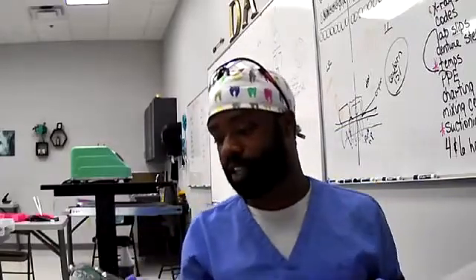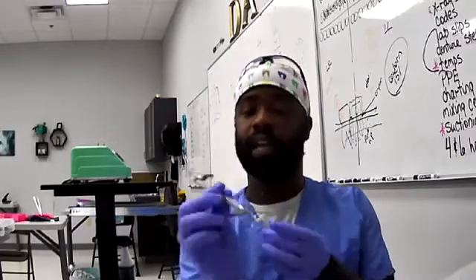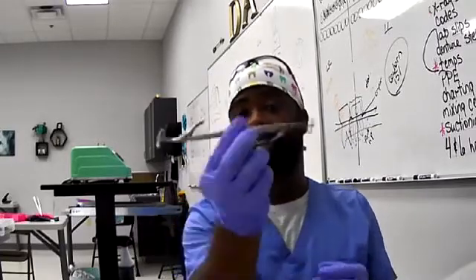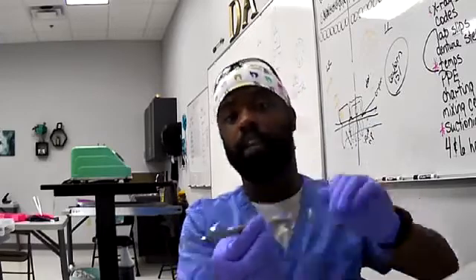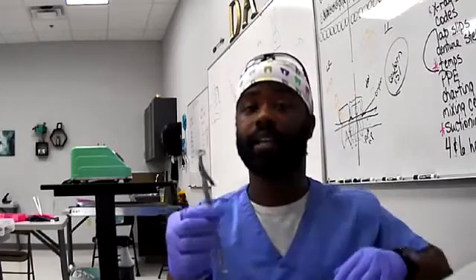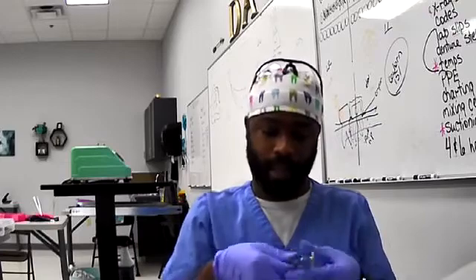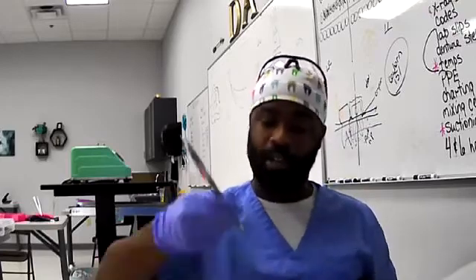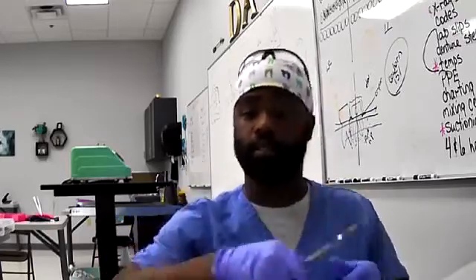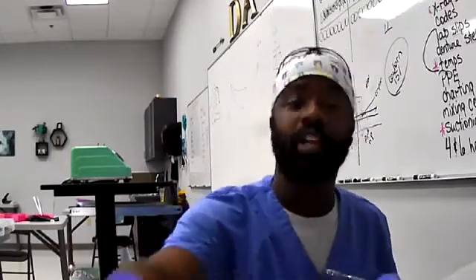If you're going to work with the big side first, then you want to hand the dentist that side down. Okay. So if I'm handing it to you, you're the dentist, and this is the big side, I would hand it to you like this. That way, if I'm the dentist, I grab it and put it right into the tooth, hand it to you, or swap sides, hand it to you, and then go from there.